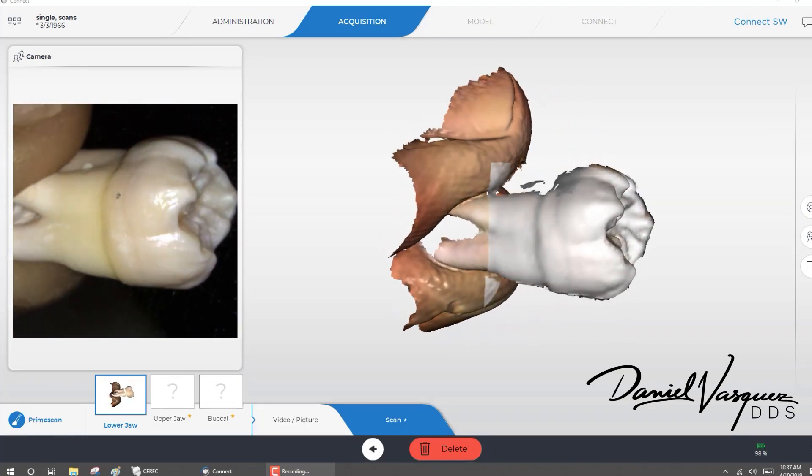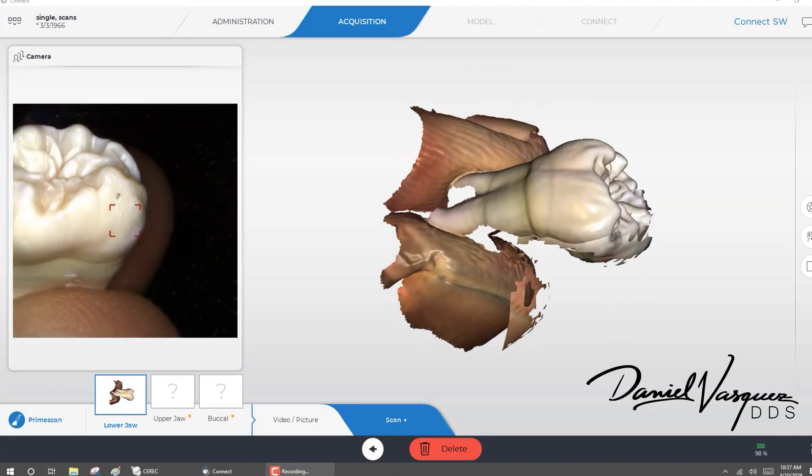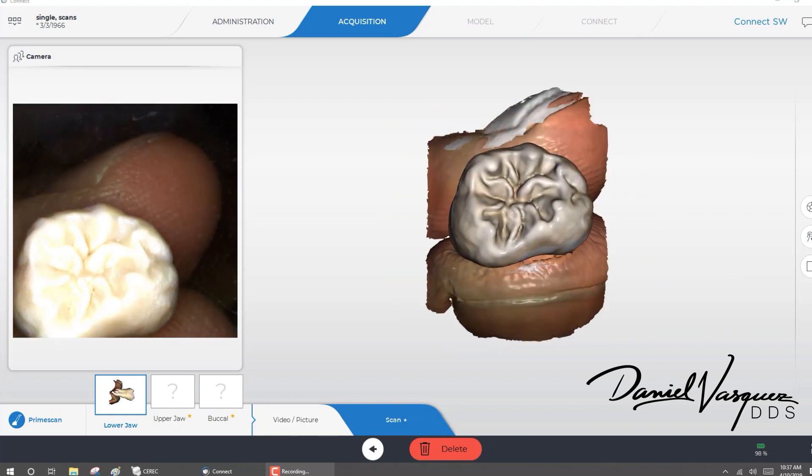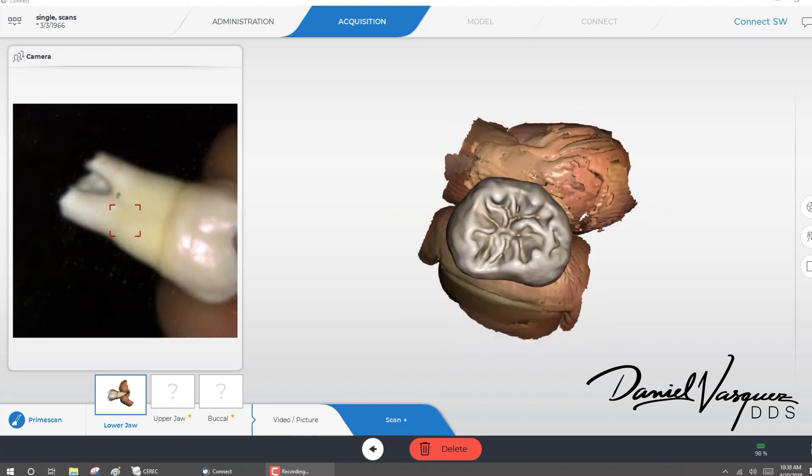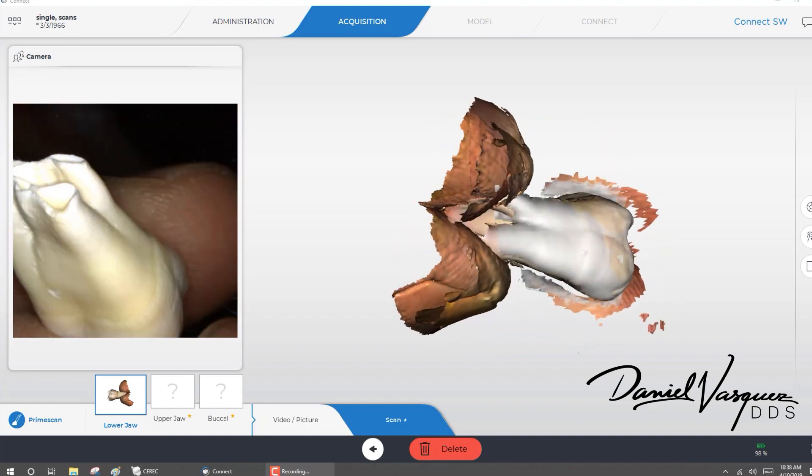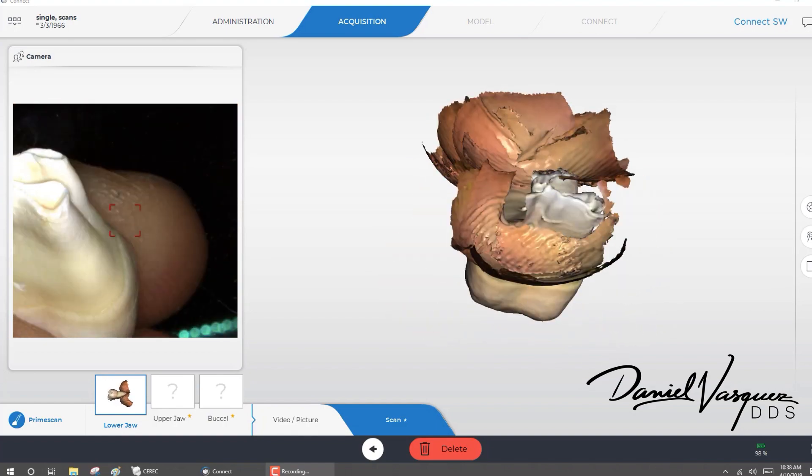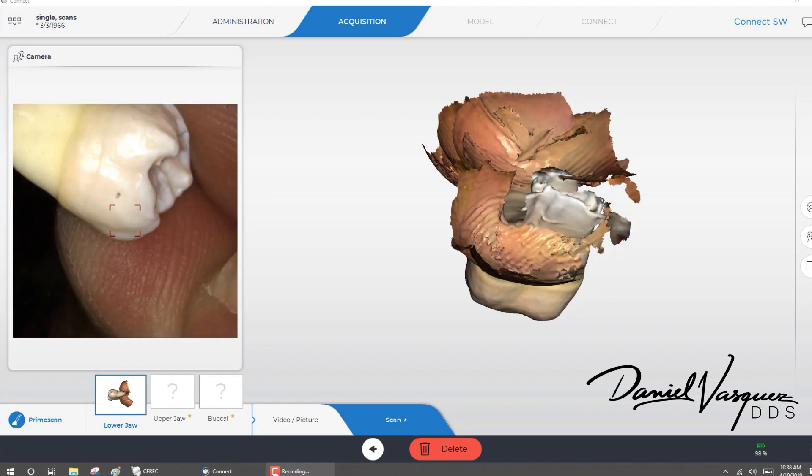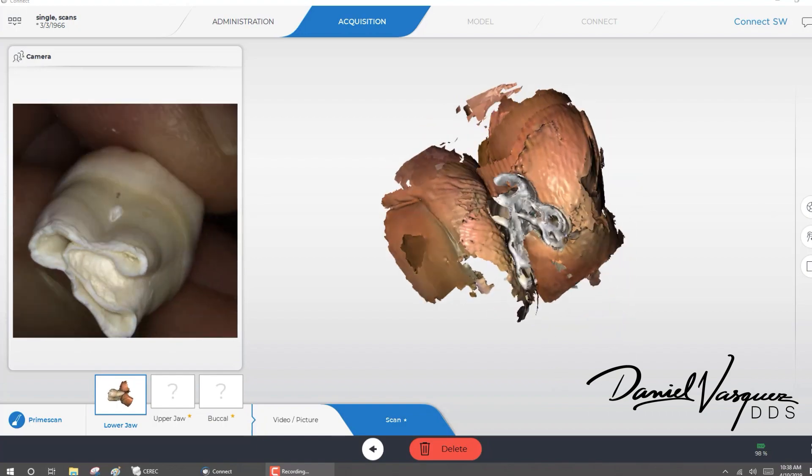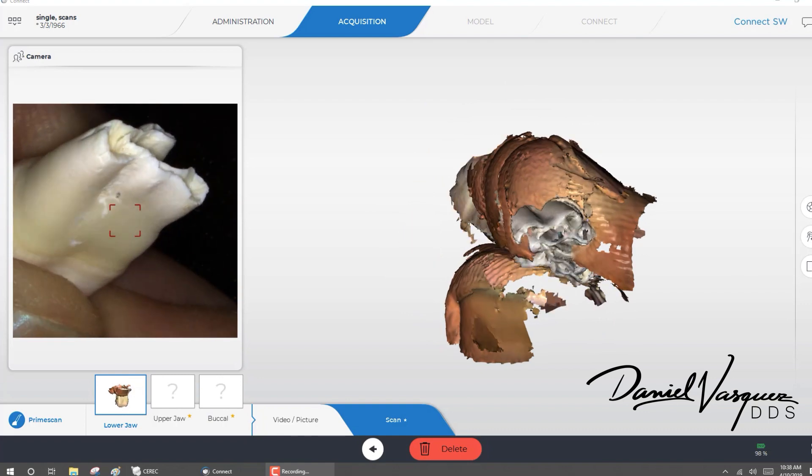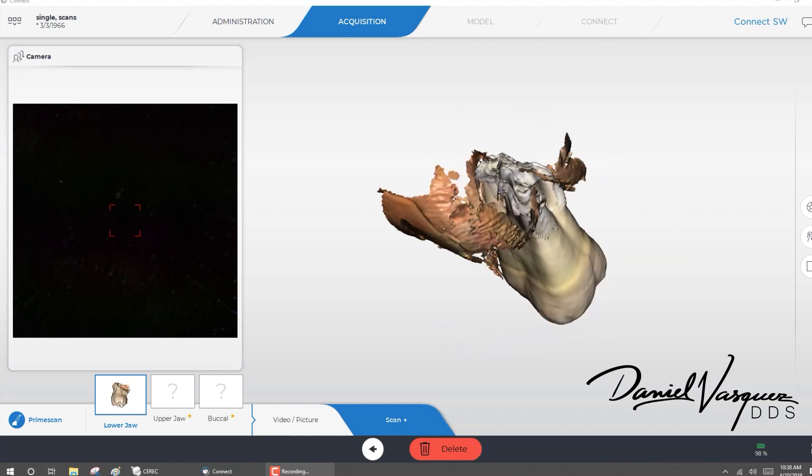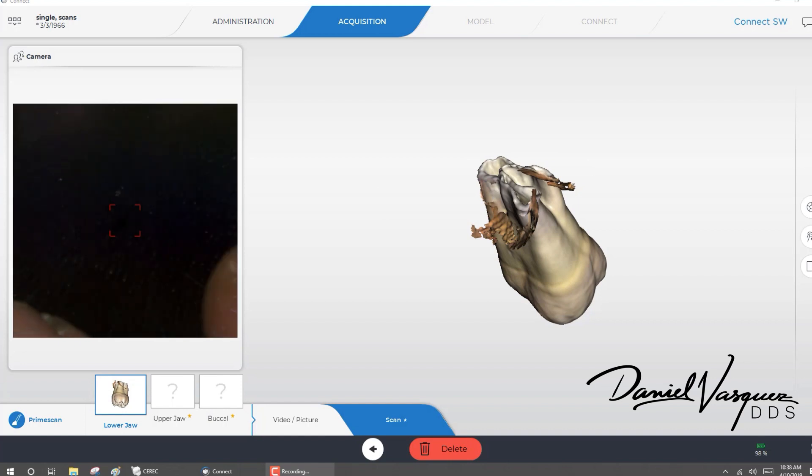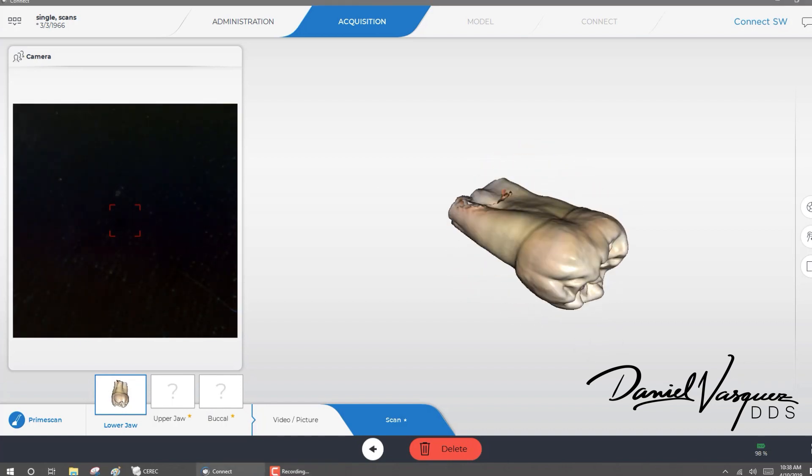Hi, I'm Dr. Daniel Vasquez and look at this. This is just crazy. I'm scanning an extracted tooth. You can see my fingers and one of the things that this crazy Prime Scan has is artificial intelligence that's going to remove all the objects not related to the tooth. I can go all around. It will scan and it's just going to clean everything. This is crazy. Look at that.